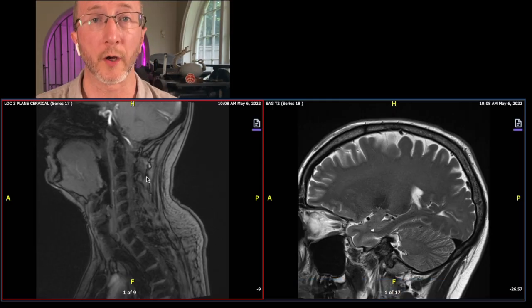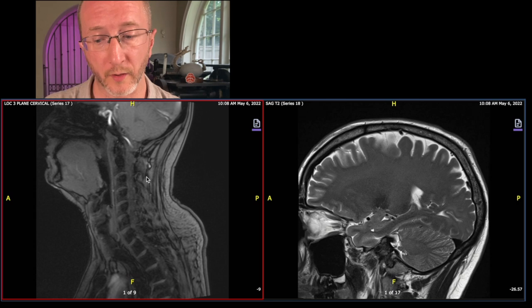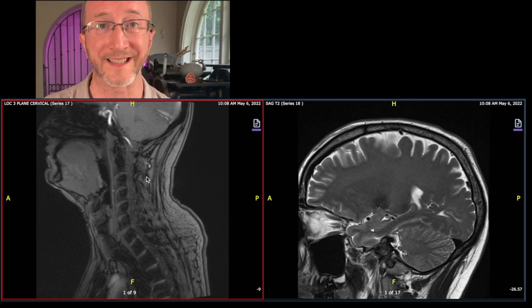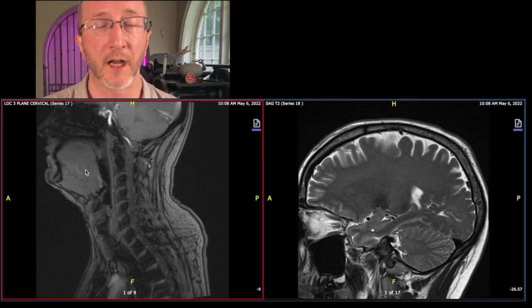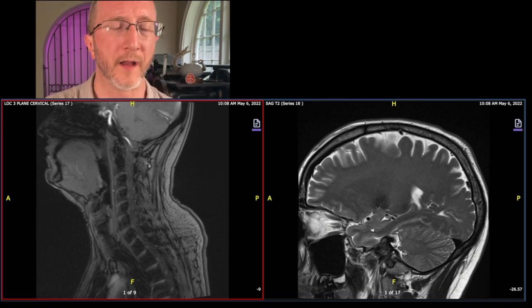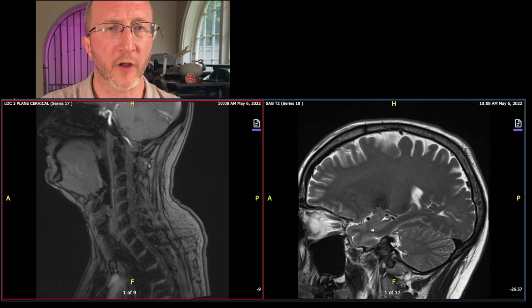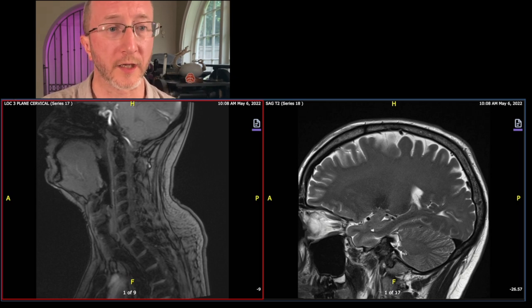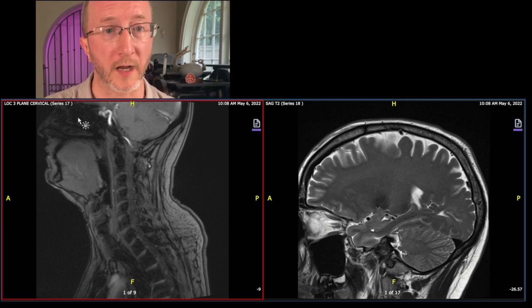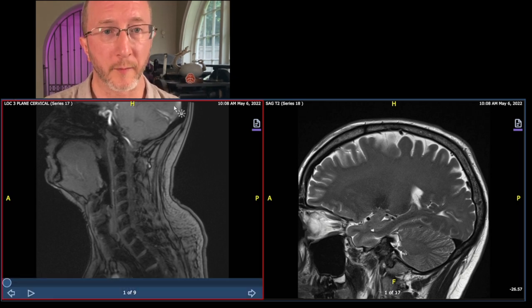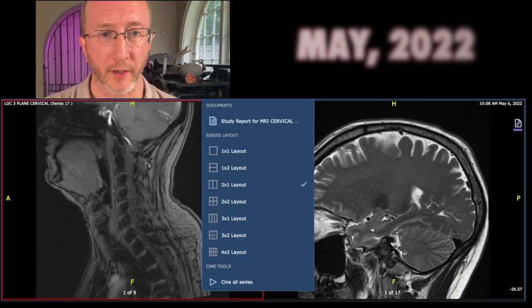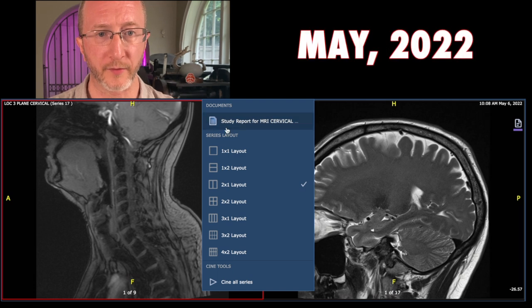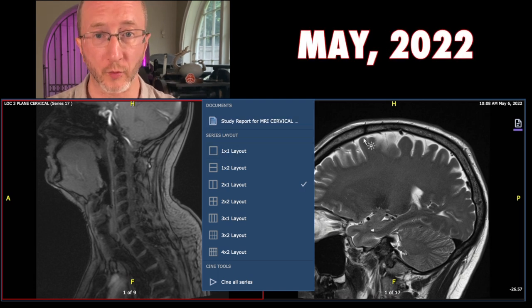Today, I want to bring you along as I review a very intense case of a dear patient of mine. We'll start off by looking at some MRIs of the cervical spine from about a year ago, May of 2022.